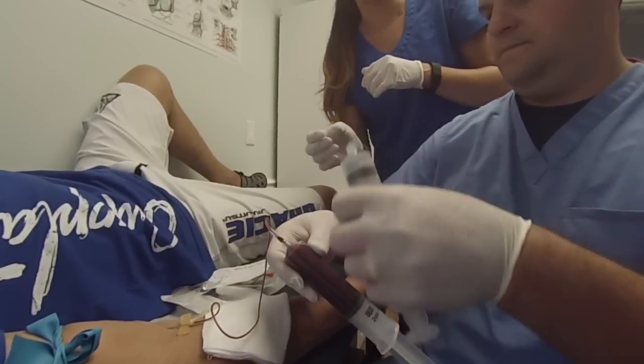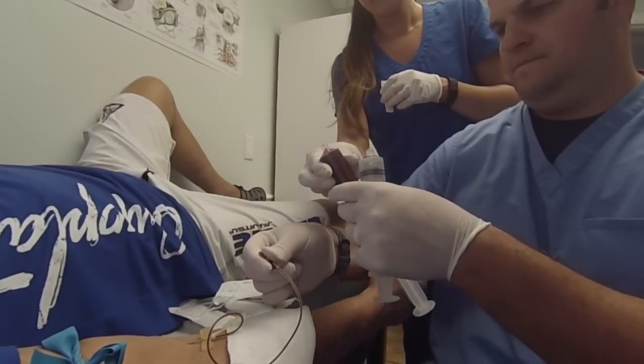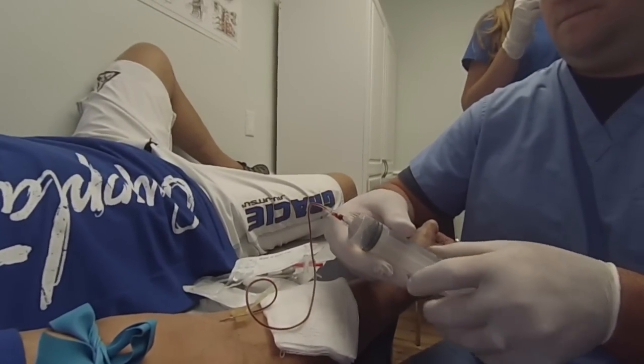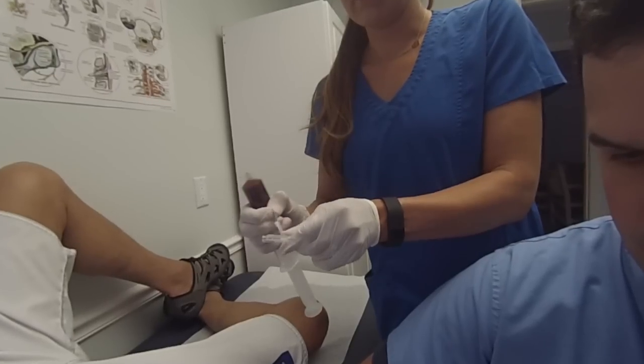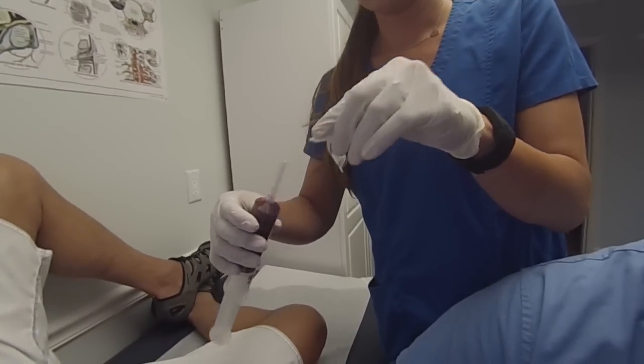Pinch the extension line on the butterfly to prevent blood flow and carefully disconnect the syringe containing 45 mLs of anticoagulated blood and pass it off to a second operator. The second operator will connect a blunt plastic cannula to the syringe and gently invert to adequately mix the whole blood and anticoagulant.